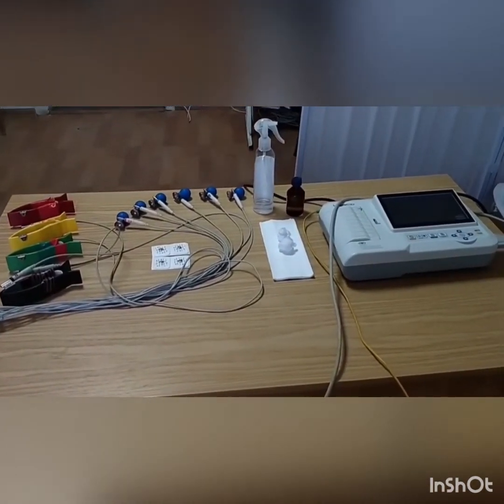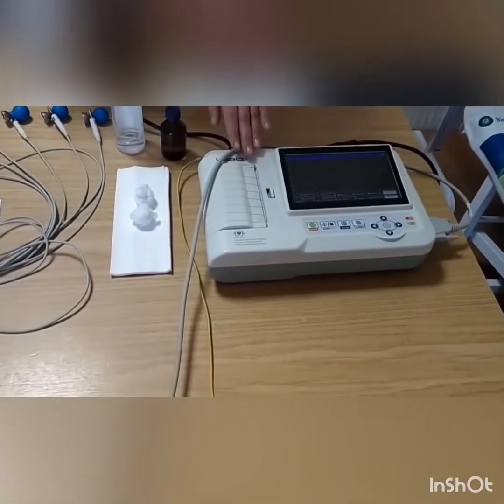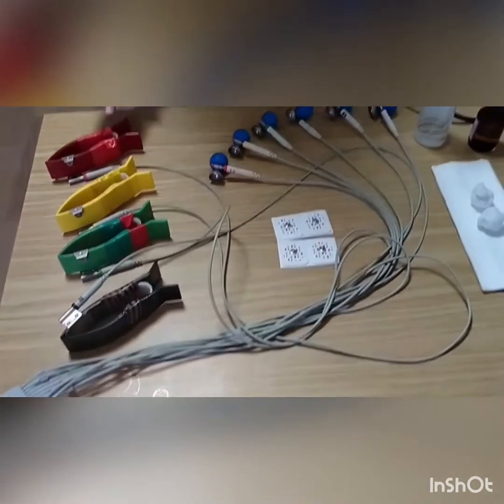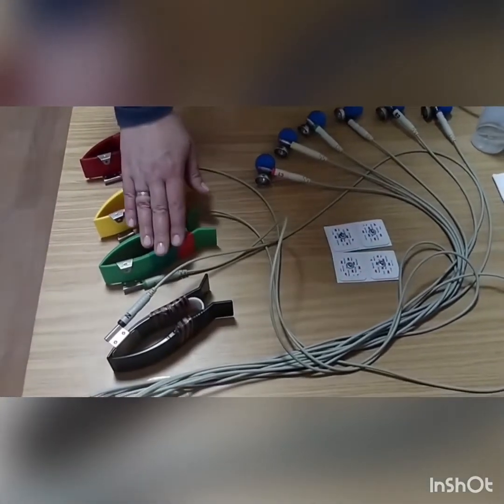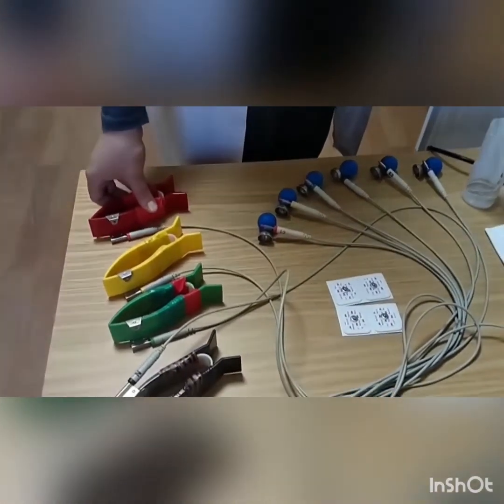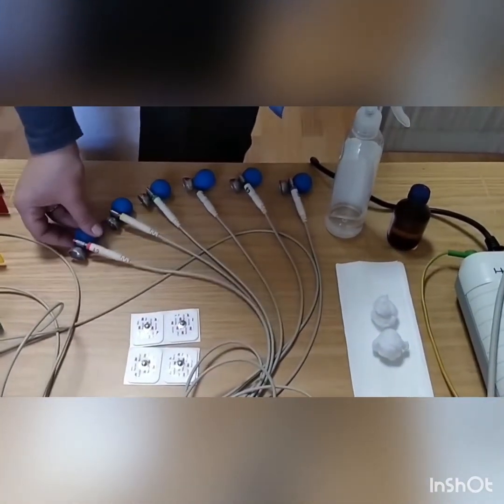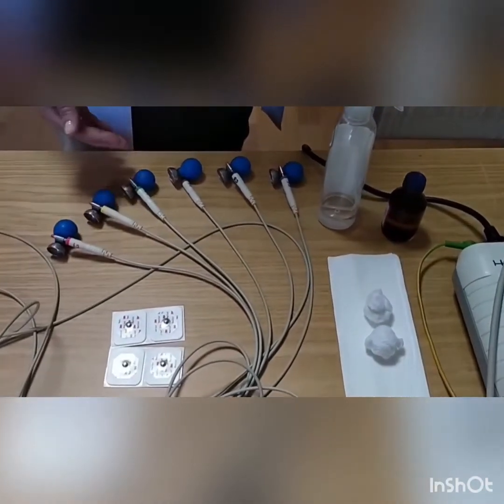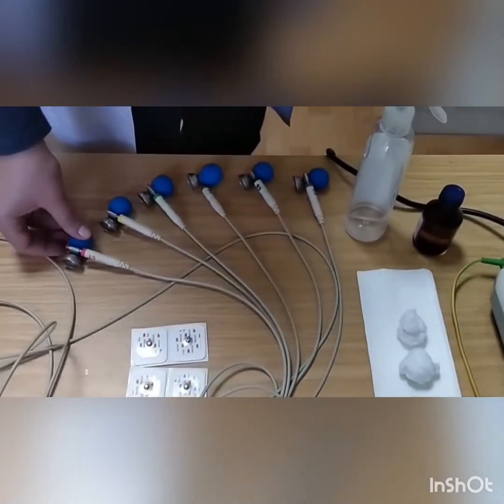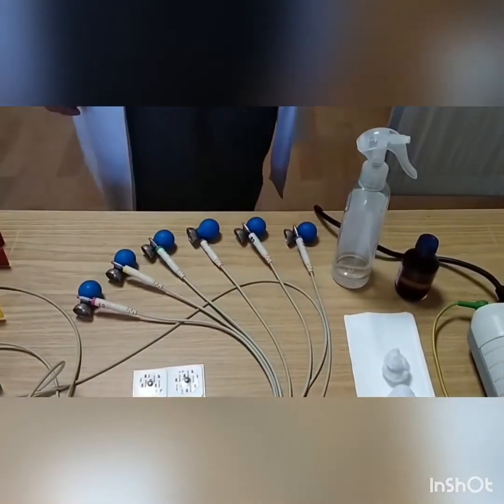Electrocardiographs consist of the apparatus itself, where we register graphic images of electrical impulses from the surface of the body. Electrodes are also presented. To record standard leads, we use clip electrodes, which are color-coded: red, yellow, green, and black. For children, clip electrodes are used somewhat smaller than for adults, but for teenagers we can use clip electrodes like for adults. To record the chest leads, we use suction cup electrodes, which are also color-coded: red, yellow, green, brown, black, and violet, or V1, V2, V3, V4, V5, and V6. For children, suction cup electrodes with a diameter of 15 mm are used. For older children, we can use electrodes with a diameter of 24 mm.